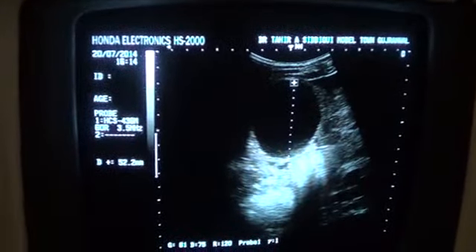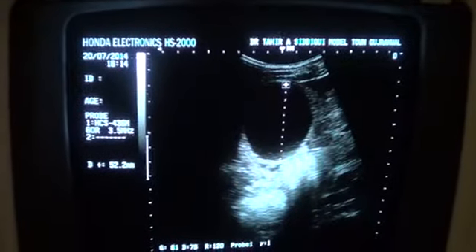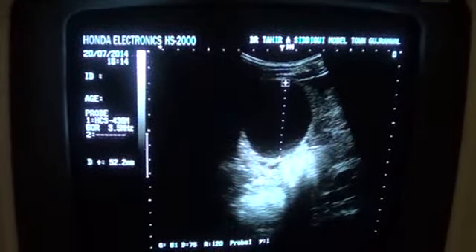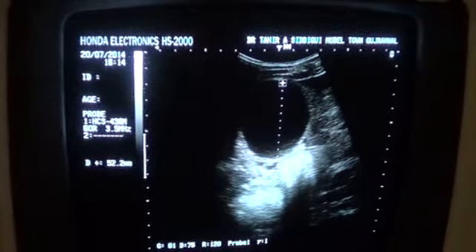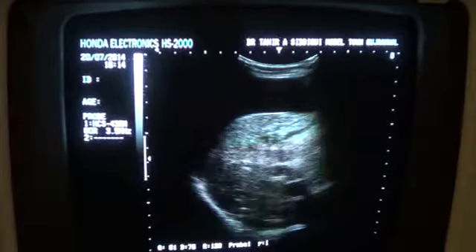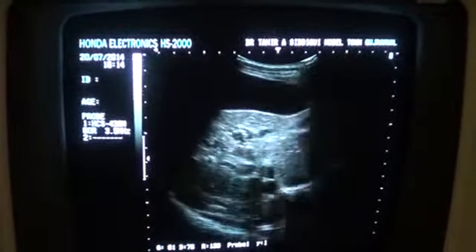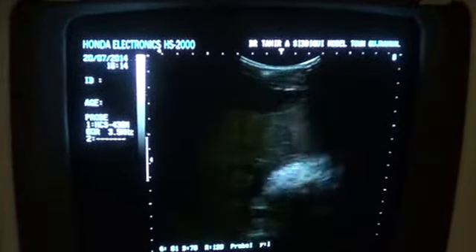So this is a dilated gallbladder, internally free of any calculi, debris or focal mass lesion. So this is very much consistent with a distended gallbladder with dilated intrahepatic bile ducts. Now, obstructive jaundice is definitely there, no doubt about that.